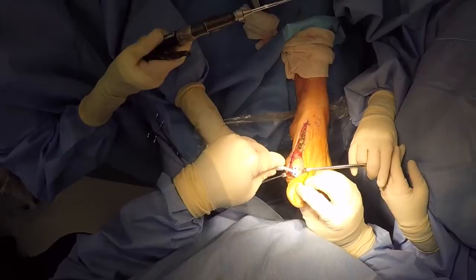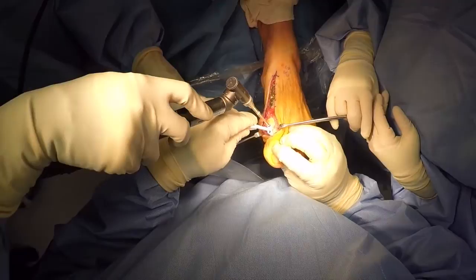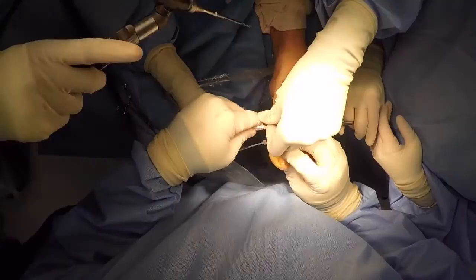This is a drill guide for an 8mm staple. The drill has a hard stop on it, and this is only unicortical. There is no need to go bicortical with this drill in the proximal phalanx. So a pin is also placed here, because soft tissue interposition can be a problem when you attempt to find your holes for placement of the staple.